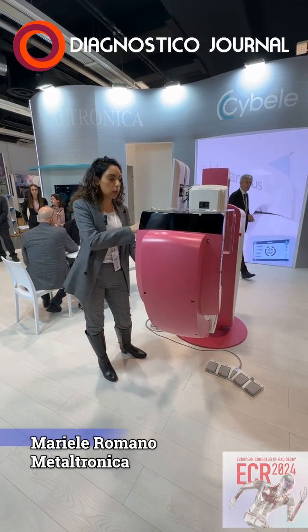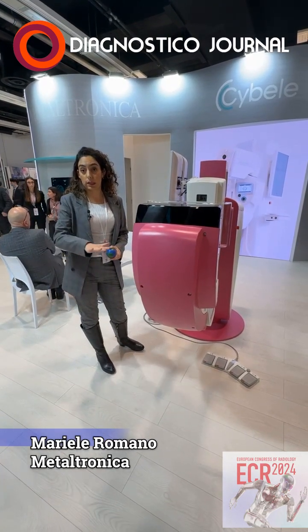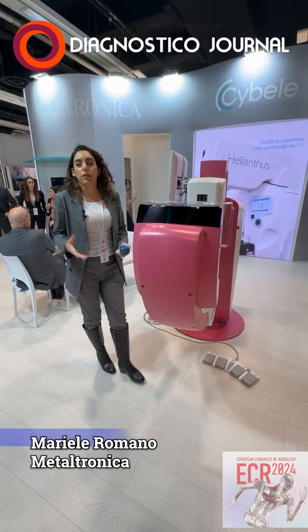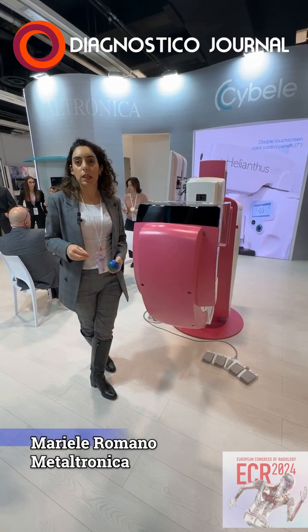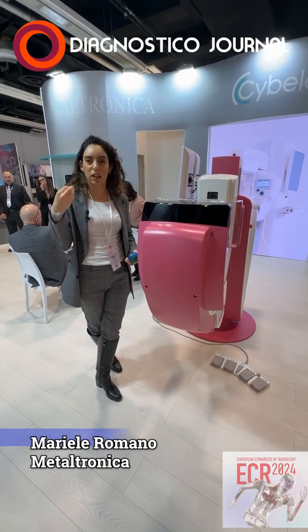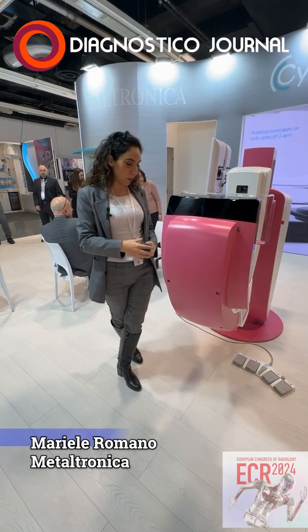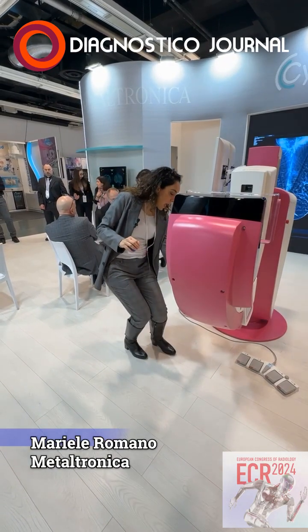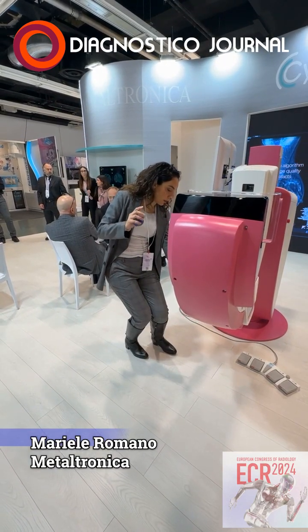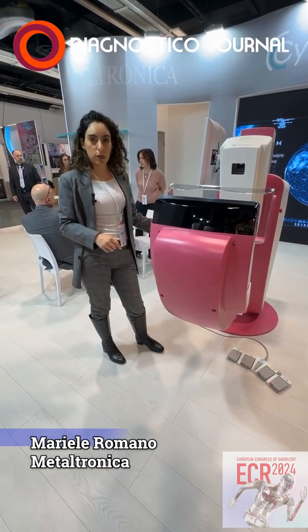So it moves down, and then so that the patient can lay on a bed that is here, and she doesn't need to have this distress of having a biopsy and being so high with the bed and having a look of all these devices that are not comfortable. As last, I will put it up and show you the other options that we have.